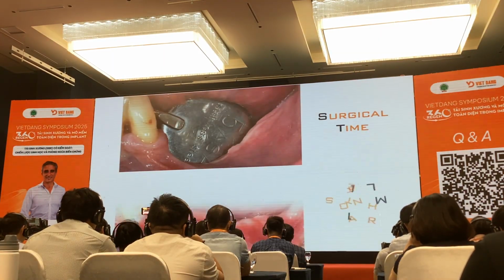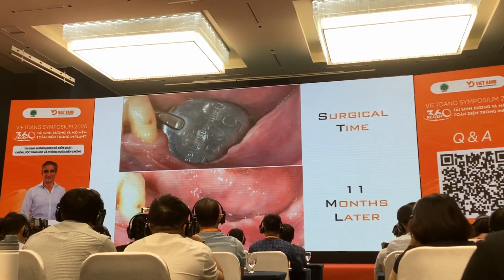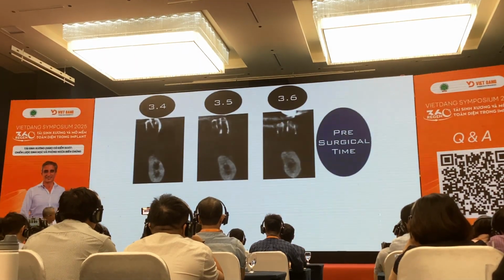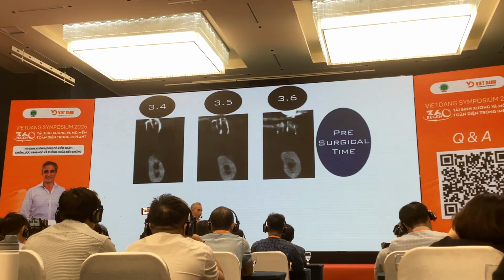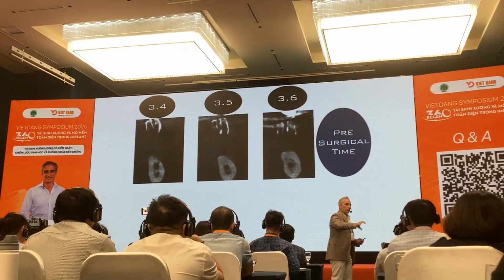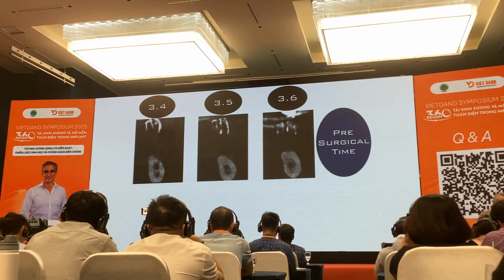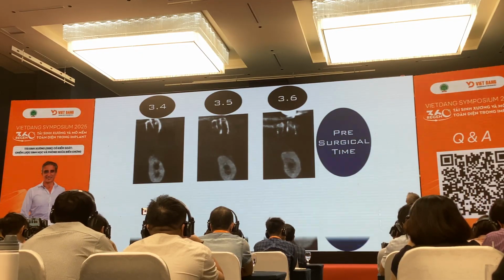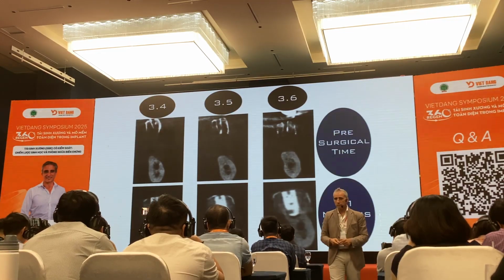And naturally, this is the new profile. We restore completely the missing volume. And it's very interesting to evaluate the behavior of the bone in relationship with the removal of the membrane and the placing of the periosteum against the bone. This is the case before the surgery, and this 11 months later.